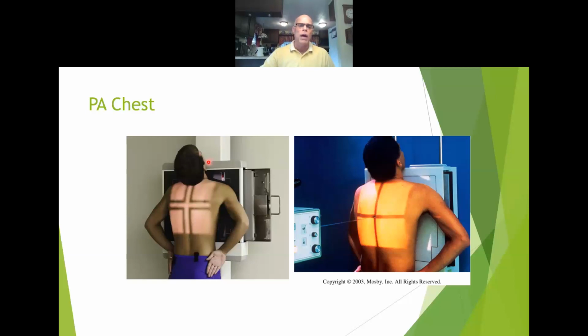We talked about this right in here. I don't know if you can see that, but there's a little notch up here where you're supposed to have their chin. This guy here looks like he can tolerate it. This little guy here, it really looks like it's stretching his neck, and I prefer not to do this to my patients. I'll have them just back out of that little groove and say, just look forward, so that the back part of the occipital of the skull is not obscuring anything that you need to see as far as a chest x-ray.